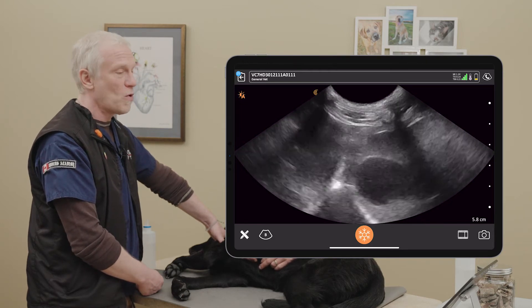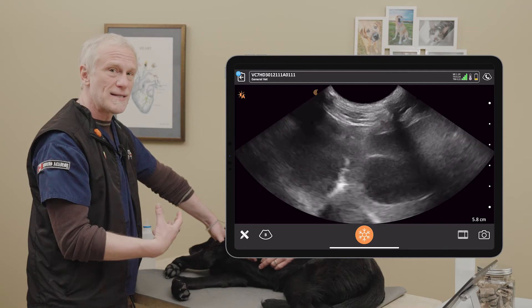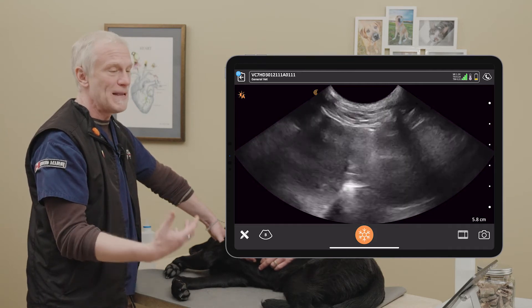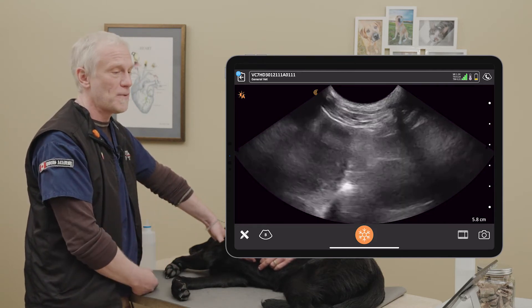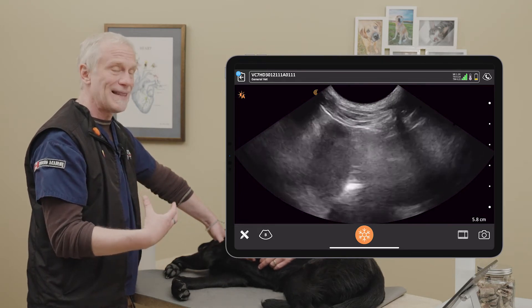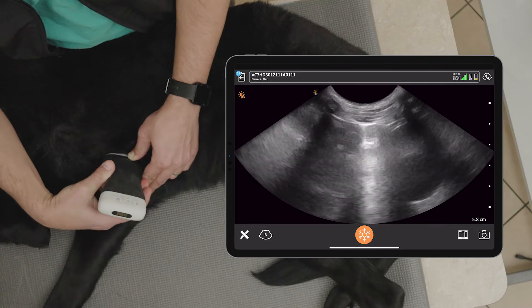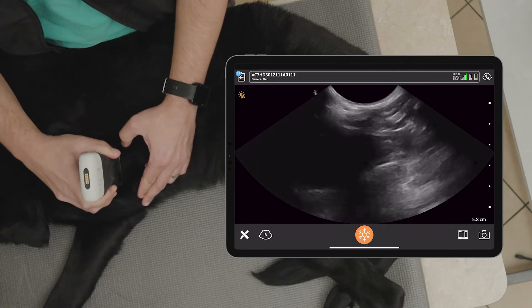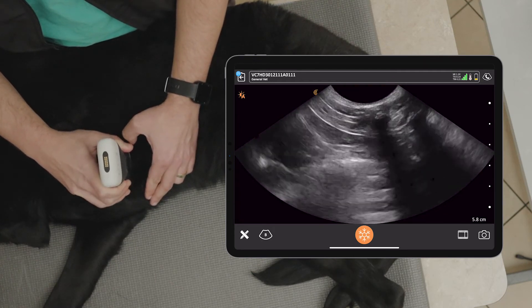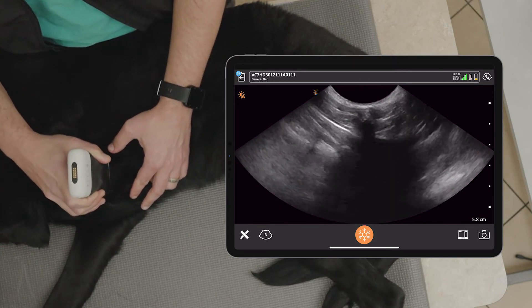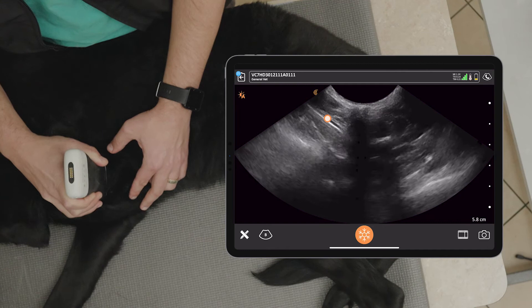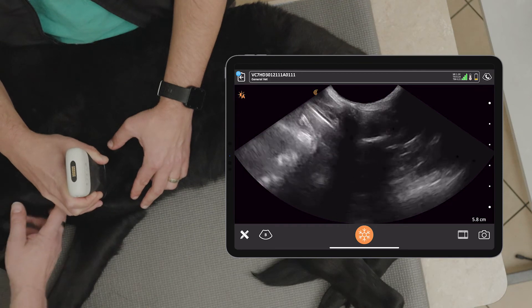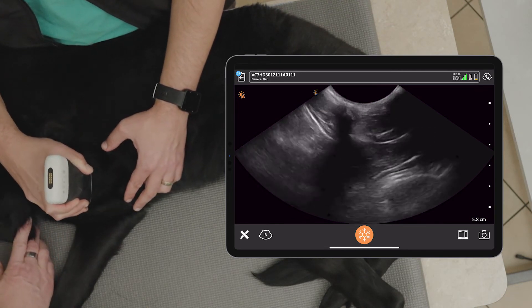If it's a small quantity of fluid that might not be causing respiratory distress but could give us diagnostic answers — if we see that fluid, we tap it, analyze it, maybe it comes back as septic or carcinoma — we can look for small amounts of fluid at this location by turning the probe parallel to the ribs with the marker directed dorsally. That gives us that classic ski jump sign. Serge has the probe parallel to the ribs, just a little over the abdomen, so he jumps one rib cranial, and that puts us on the lung where it curves down. We're looking for that ski jump sign where the lung comes along the chest wall and curves along the sternal muscles.